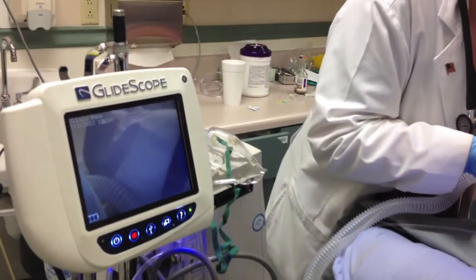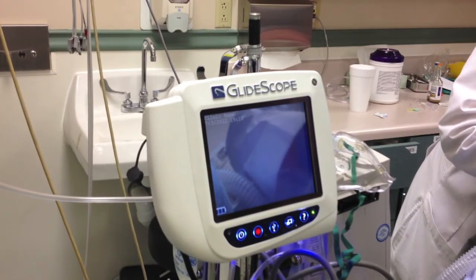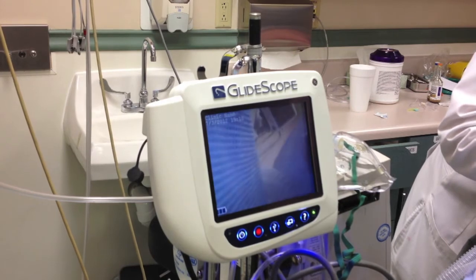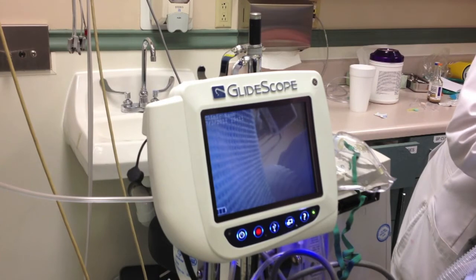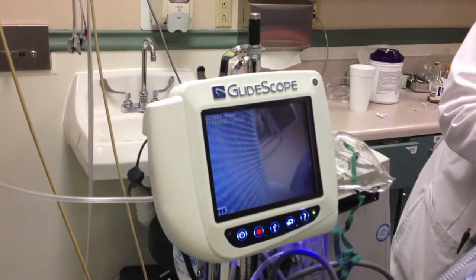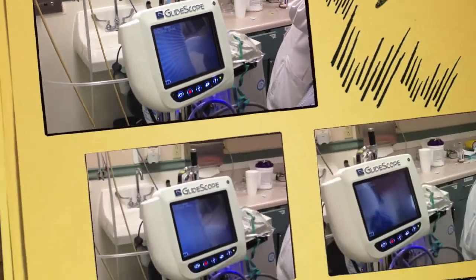The second time around, I used a regular blade — I guess I'm old-fashioned. I've used it for a long time and it allows me to see things better, and once I'm there it lets me push the tube right in. Glidoscopes are supposed to help you, especially with more difficult airways, but they do have a learning curve like everything else in medicine. You have to learn how to use them and how to do what you need to do.